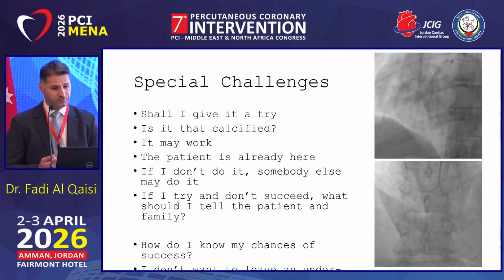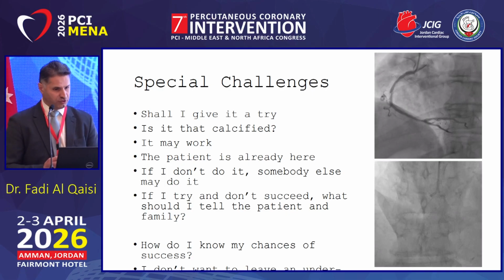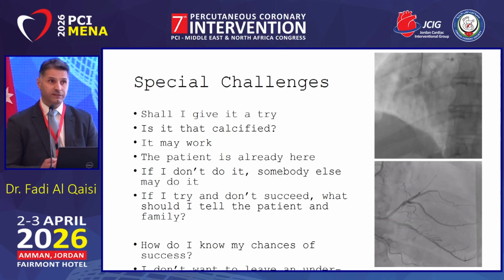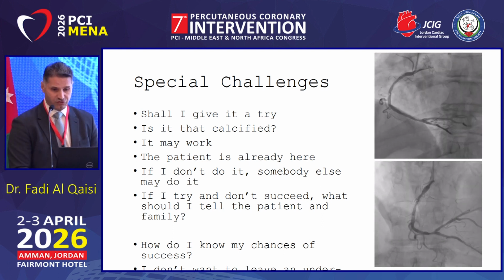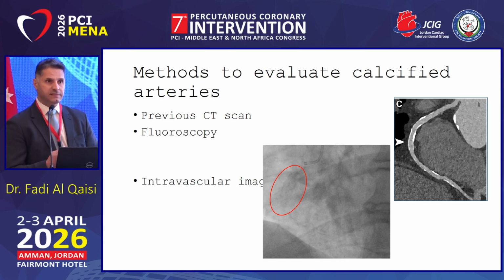The second issue: how do I know whether it will work for me or not? Can I do it or not? And if I try it, what happens if I leave an under-expanded stent? This is going to be very challenging for everybody. So we have methods to assess calcified lesions, and then you can estimate your chance of success with the traditional methods versus the need for advanced methods.